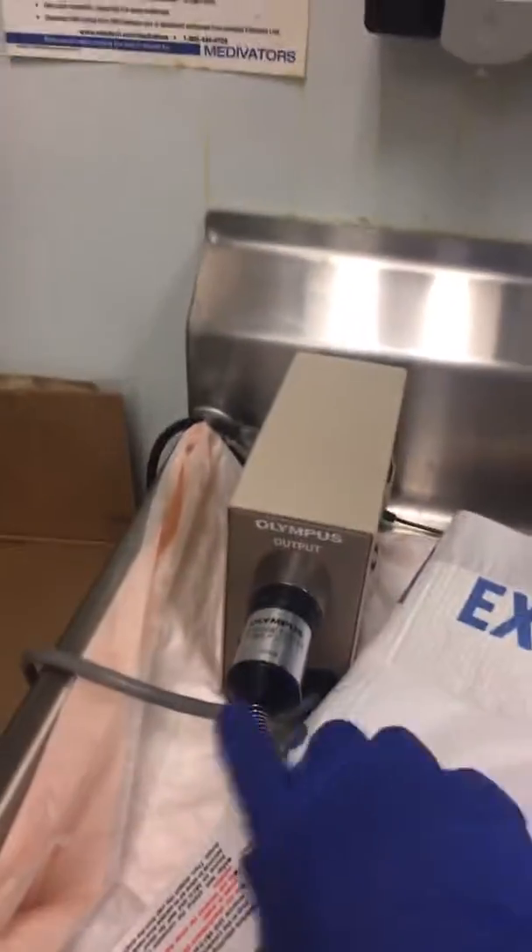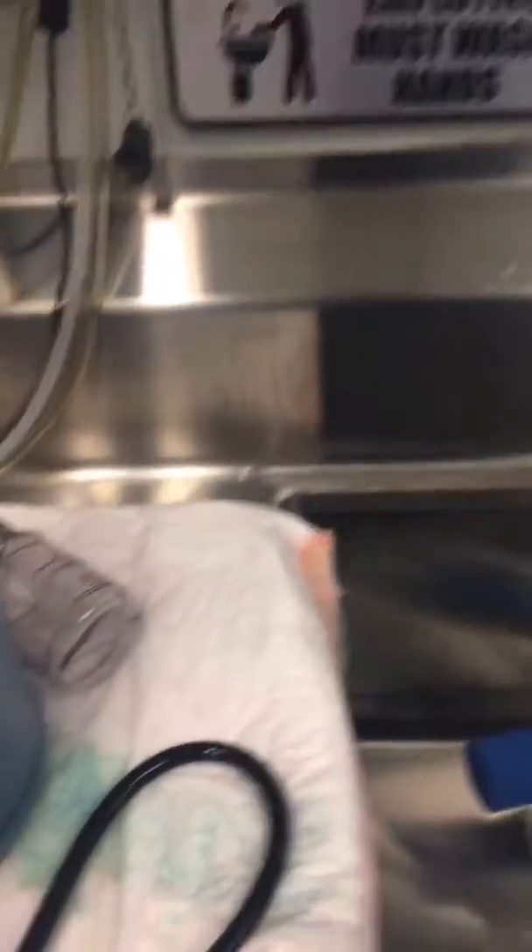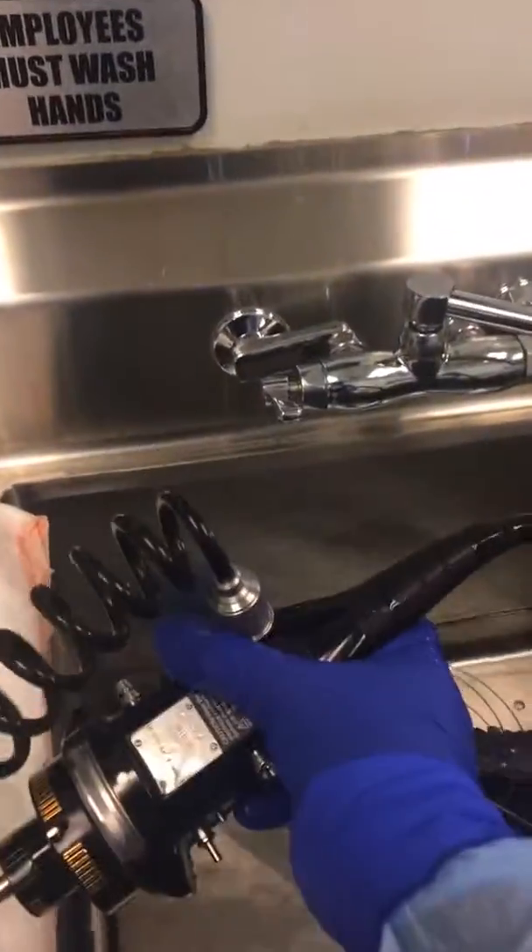Right now I have the upper scope attached to the leak tester. You connect your leak tester to your scope so it can detect any leaks that may be in the insertion tube of the scope — which is this end — or whether or not your dials are defective or your picture button may be overused and split. The scope is submerged fully underwater so that the leak testing can be done properly.